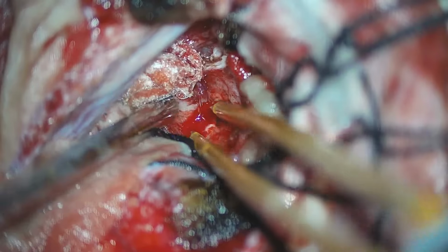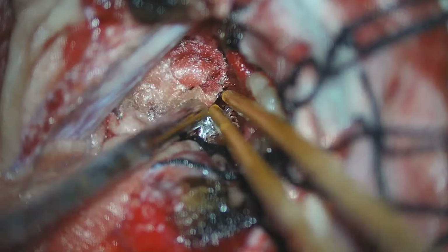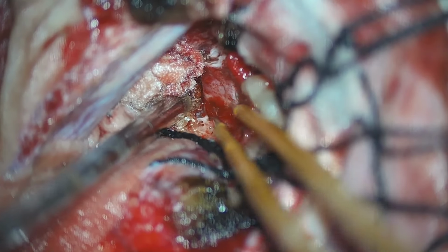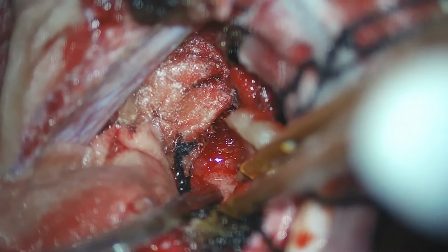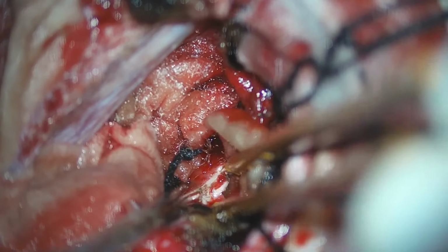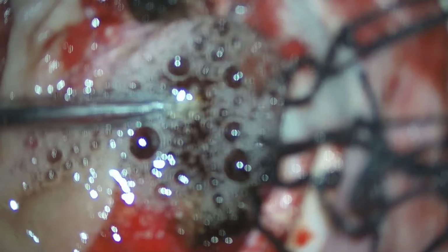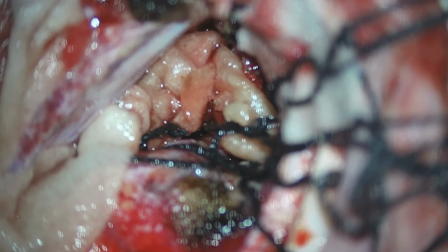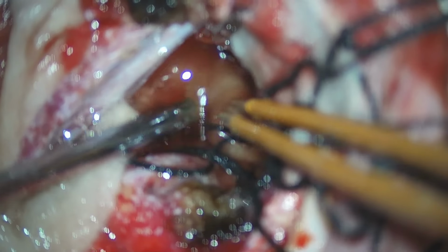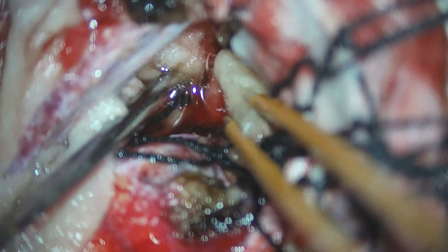Now we can see the normal brain from the undersurface of the tumor. That means we have cleared the origin of the tumor from the corpus callosum. Now we are giving a wash, and we finally go for final hemostasis and check with Valsalva maneuver. Later we close the dura in watertight fashion.